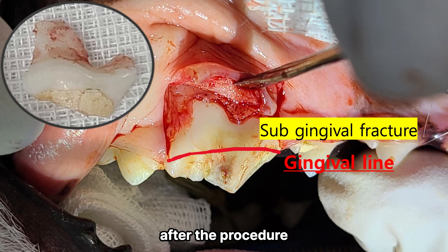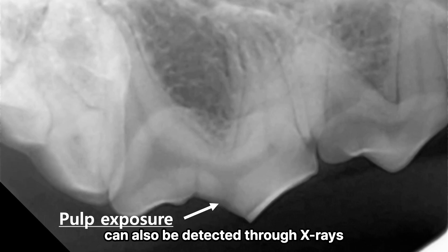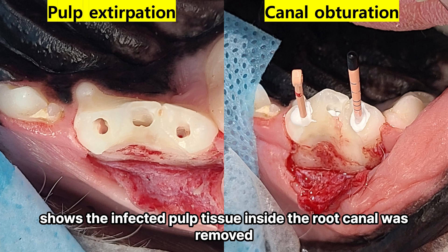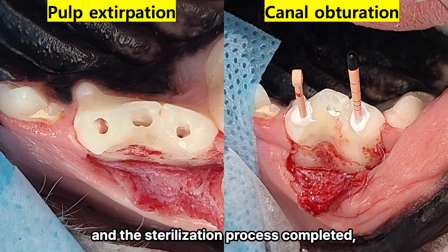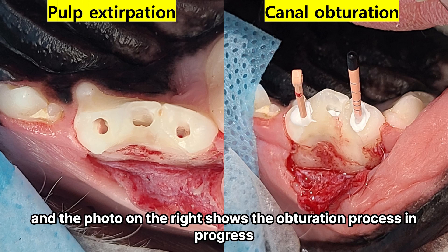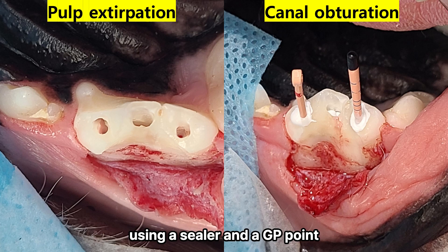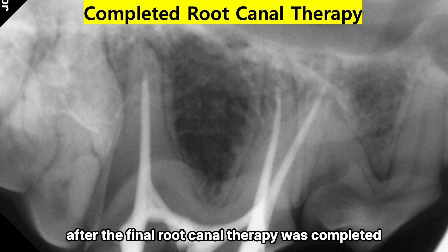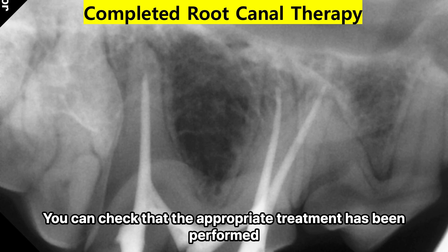After the procedure, fractures of the teeth and exposure of the pulp can also be detected through x-rays. The photo on the left shows the infected pulp tissue inside the root canal was removed and the sterilization process completed. The photo on the right shows the obturation process in progress, using a sealer and a GP point — this is an x-ray image. After the final root canal therapy was completed, you can check that the appropriate treatment has been performed.